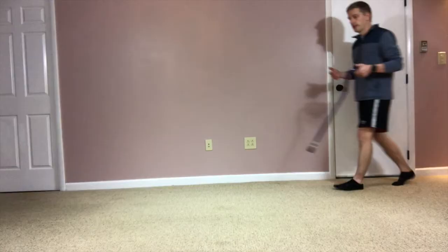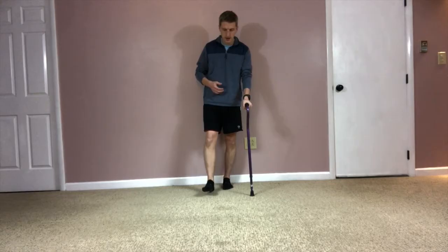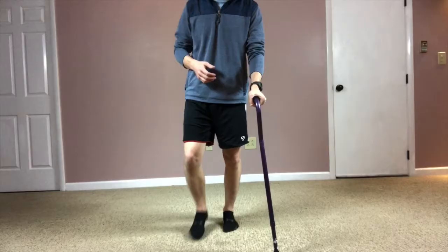Now, if you're really struggling with your mobility and having a tough time walking and getting around, for pain or stiffness or whatever reason, you can do a way that is a little more stable, but you're going to be walking a little bit slower and it's not as normal a gait pattern. With this way, what you would do is cane, surgical leg, opposite leg. Cane, surgical leg, opposite leg.